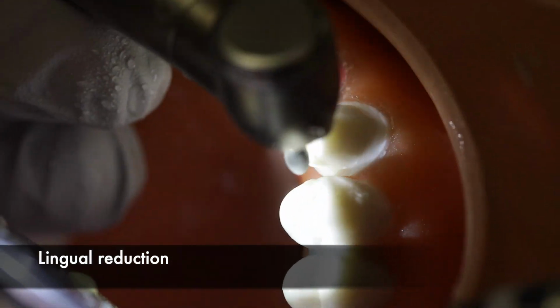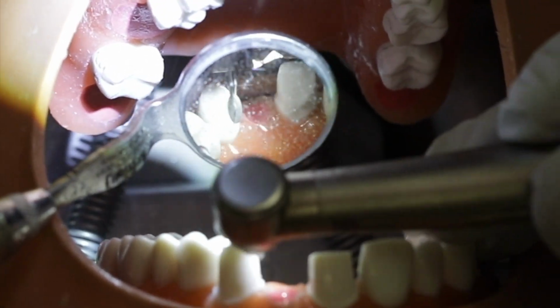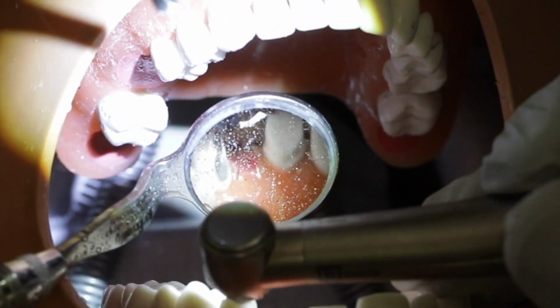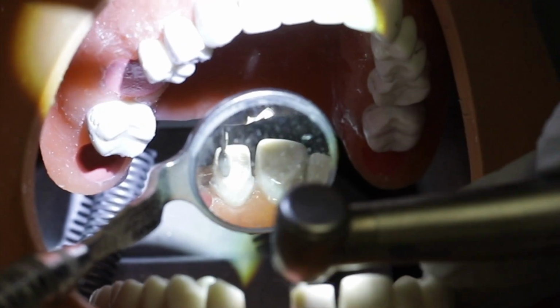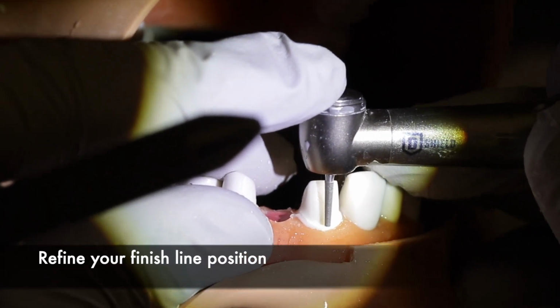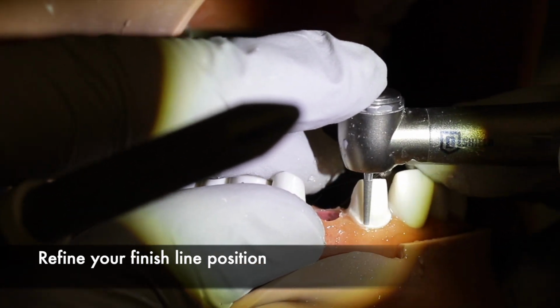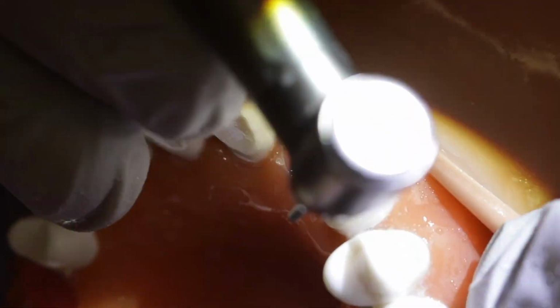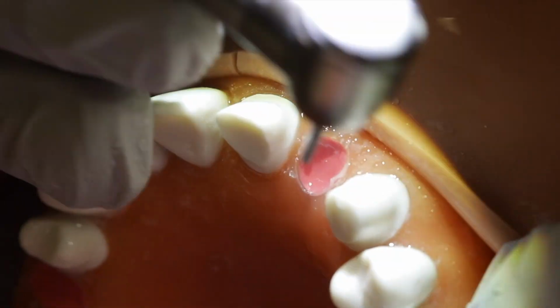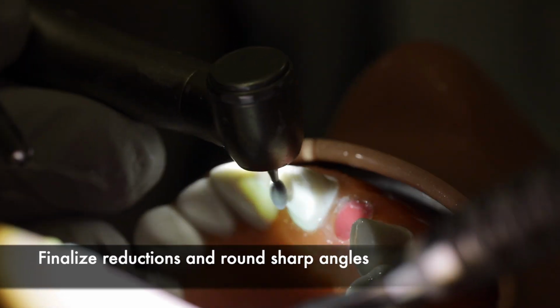After that, I use the American football bur to do my lingual reduction. At this stage, I use a rounded shoulder bur to refine the position of my facial finish line, and then you can also use a rounded chamfer to do the lingual finish line as well. The junction between the facial shoulder and the lingual chamfer stops midway in the interproximal.